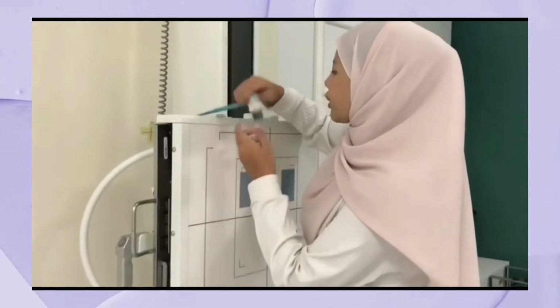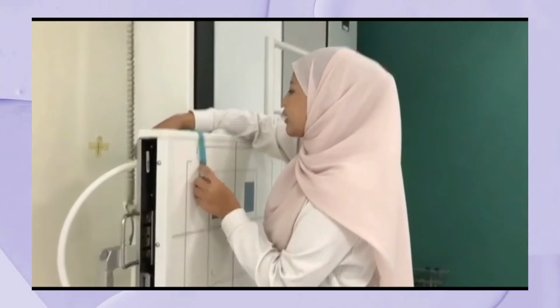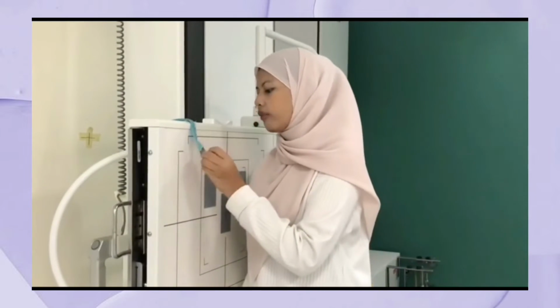When doing a projection, we'll have to use this marker. This marker is to determine the patient's right or left side of the body. When doing a projection, you must not forget to use the protection shield.